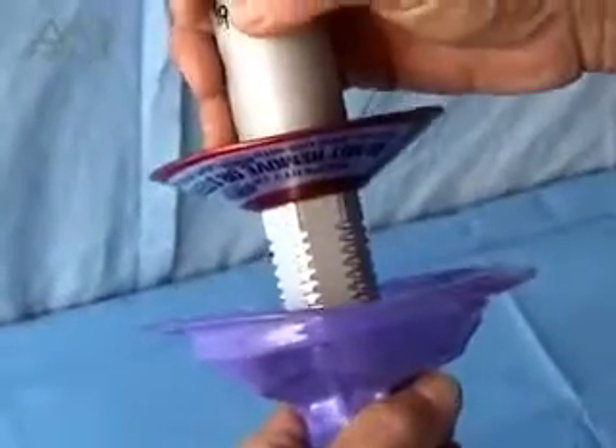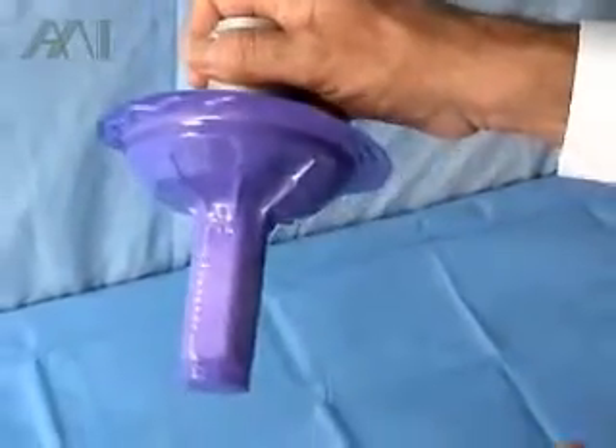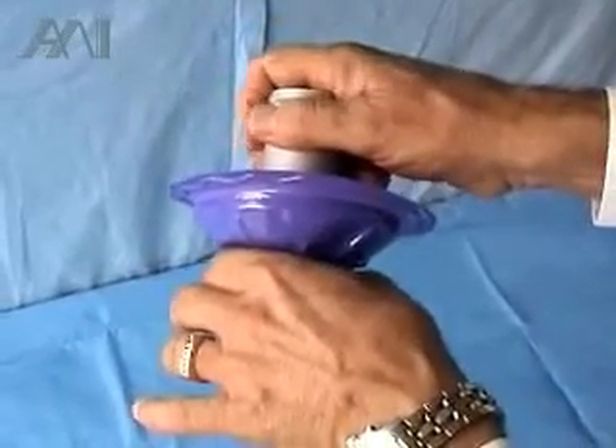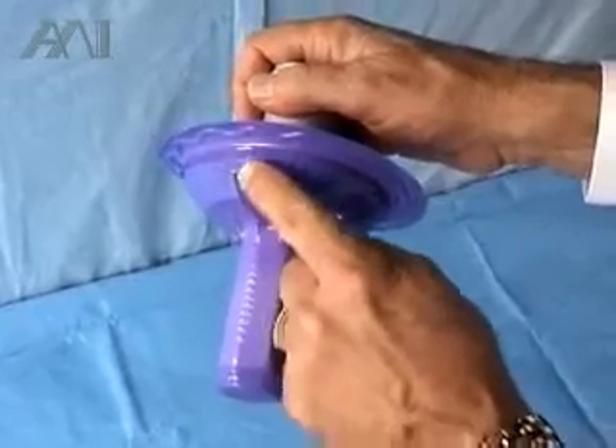The first operation is twisting the cover on the light as far as it goes. You can see it was easy because a lot of force and ribs are helping you, supporting you with the right force to apply it on the light. There is a vacuum created here.